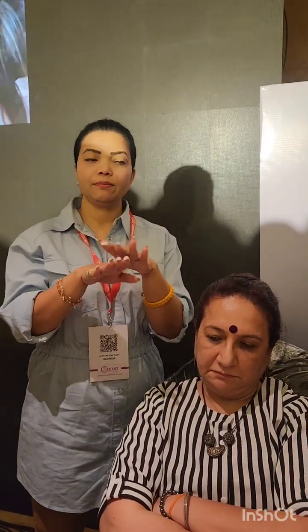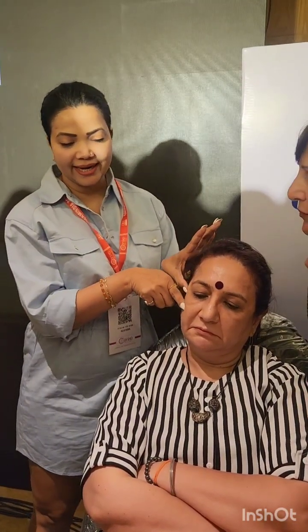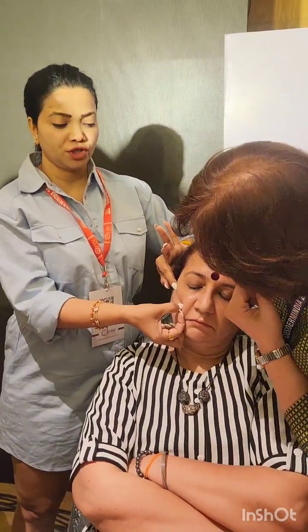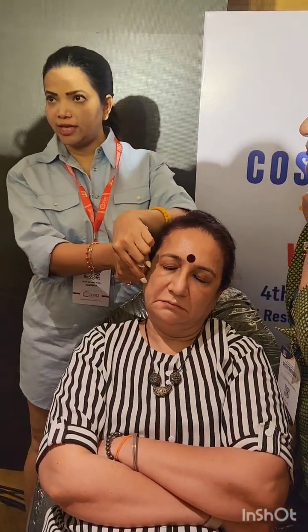To create the volume, you just need to go a little deep. But how do you get to know whether you are superficial, placing the threads wrong, or in the right plane, or in a deeper plane? If you are superficial, there will be dimpling. You can see a tract being created like this. That means you are superficial. No need to worry about it. Just pull back where you are seeing this and reintroduce a little deeper than what you were doing.